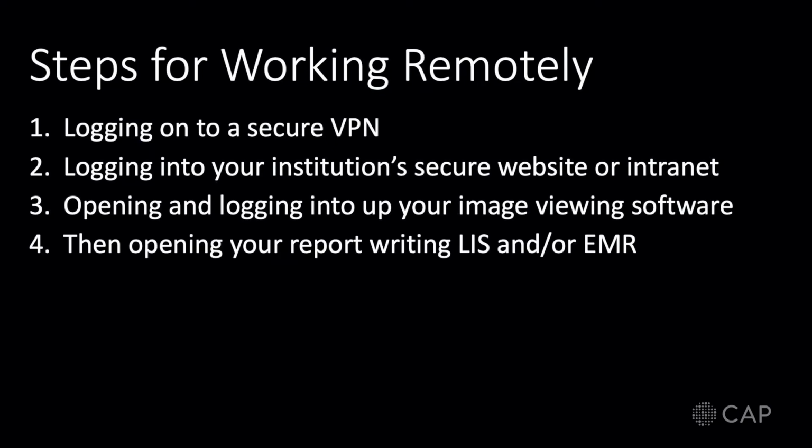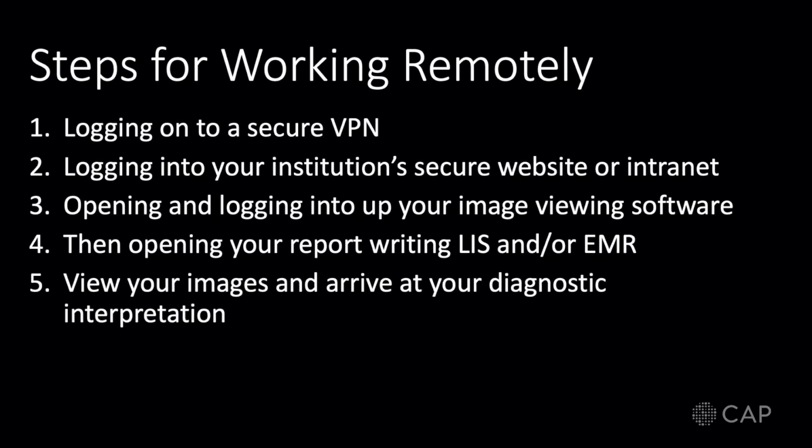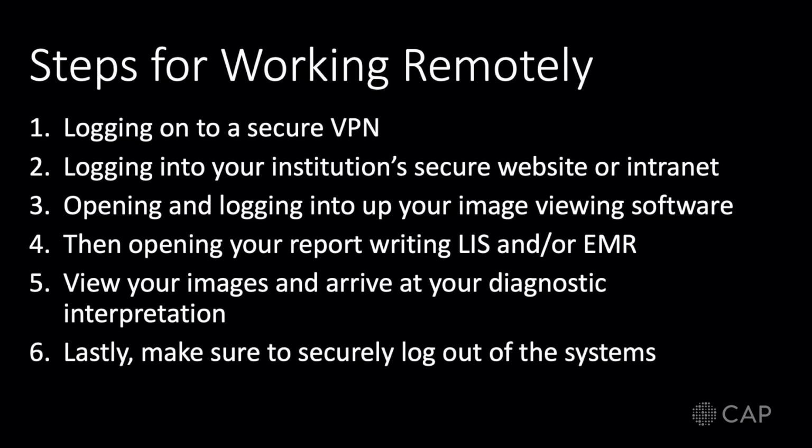If you are going to be writing reports or looking at patient charts, then opening your report writing laboratory information system and/or electronic medical record. 5. View your images and arrive at your diagnostic interpretation. 6. Lastly, when you're done, please make sure to log out securely out of all the systems.